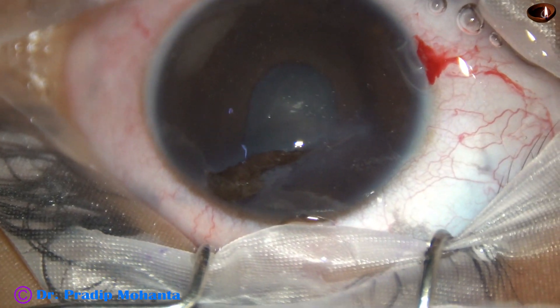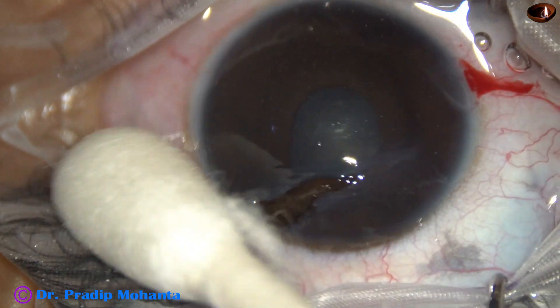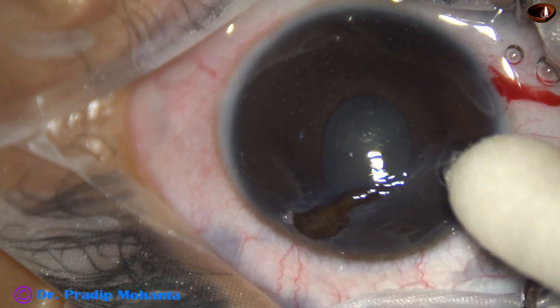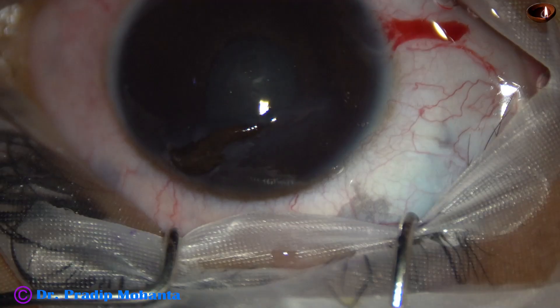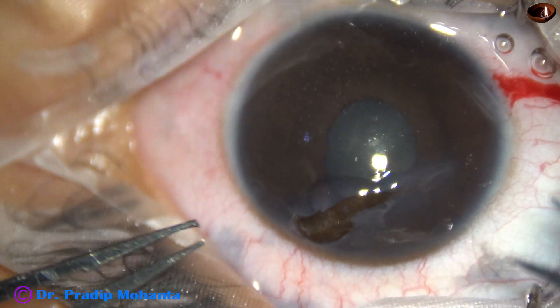By this time, a side port has been made and visco has been injected into the anterior chamber. This side port will help in anterior chamber lavage after conclusion of the surgery.